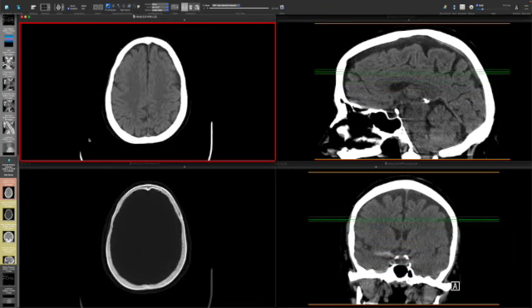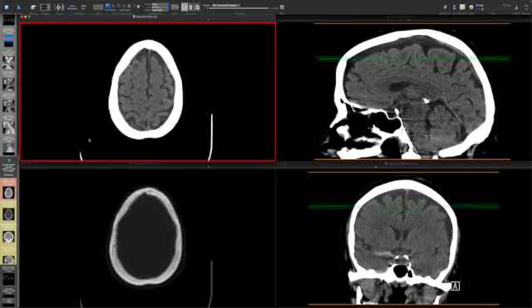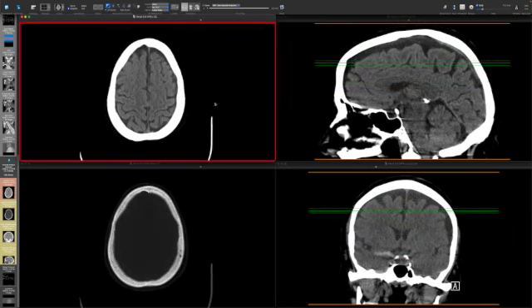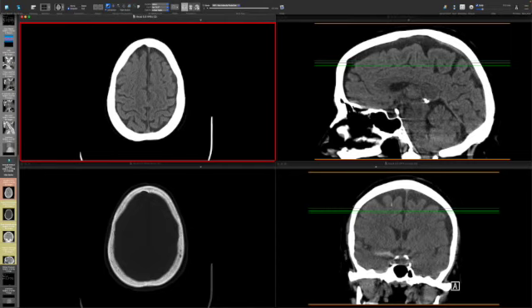And this is the non-contrast head CT. So we have the standard non-contrast head CT configuration with axial reconstructions in soft tissue algorithm and bone algorithm, and then coronal and sagittal soft tissue algorithm reconstructions.